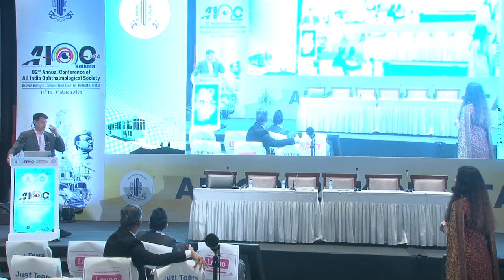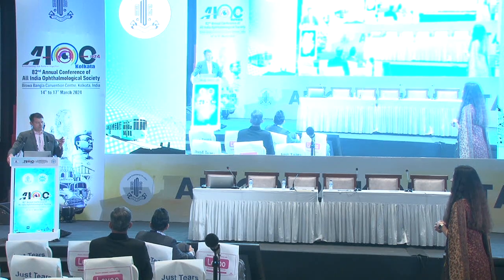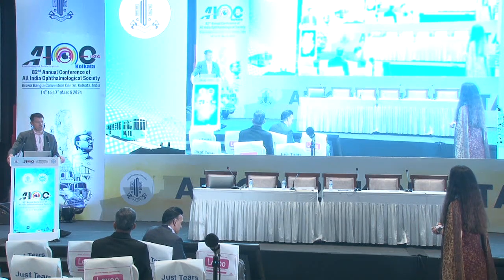I just find that sometimes pupils don't come down. Sometimes they kind of halfway come down. But even with a lens in the bag, centered, good red reflex, pupil constricted to 4, let's say, I still find on some eyes I'm trying to insert the DMEK scroll, maybe 1 out of 4, and the chamber just keeps shallowing. Yeah. And the incision's not leaking. It's just the lens is not fibrosed in the bag, and I find that to definitely be much more floppy, right? Yeah, at that point.